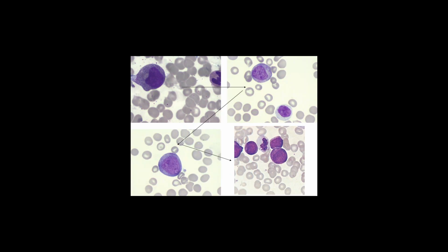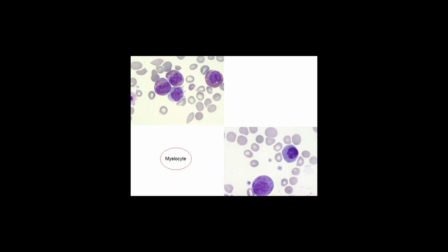These again are various cells, various patterns. The blast, this is also a blast here, a blast here. So various types of blast that we can get. These are the myelocytes. Here we can see the eosinophilic precursors. Sometimes we get a lot of eosinophilic precursors. An eosinophilic metamyelocyte, here also the indentation is there. So eosinophilic metamyelocyte. This is a myelocyte, normal myelocyte.